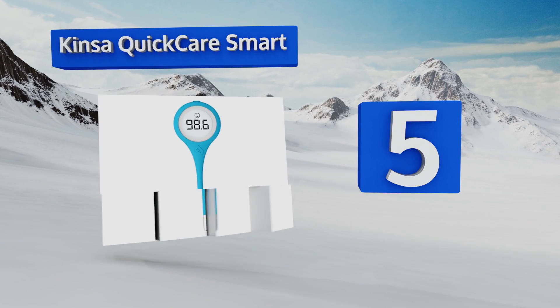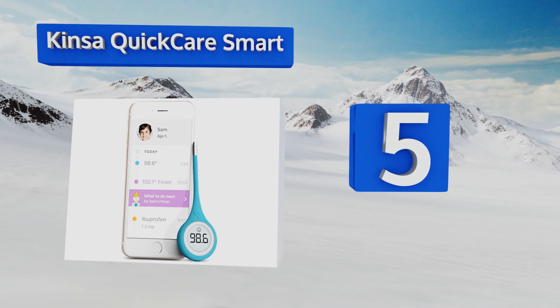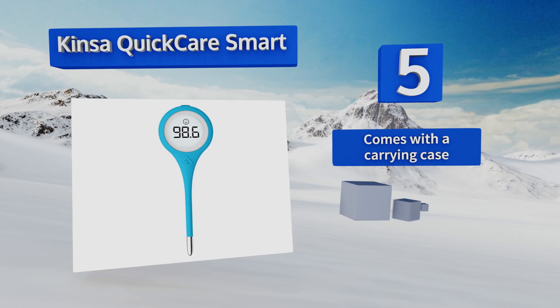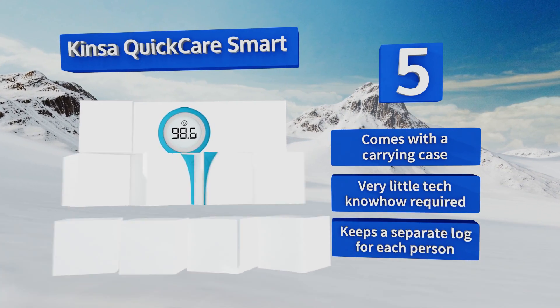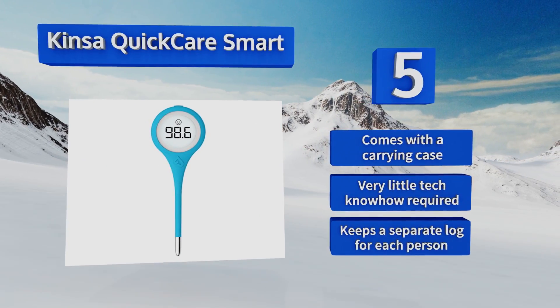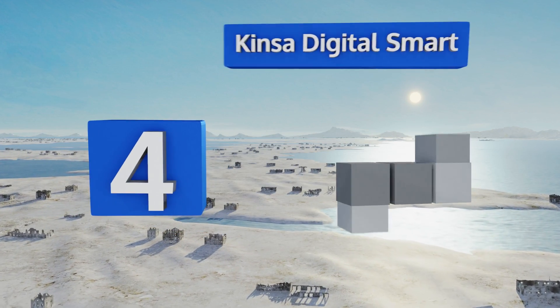Halfway up our list at number five, the Kinsa QuickCare Smart syncs with your mobile device via Bluetooth technology, allowing you to keep a detailed log of temperature readings through the free application. The app's best feature is that it doesn't need to be running — data is sent and stored automatically. This one comes with a carrying case and very little technical know-how is required. It keeps a separate log for each person.